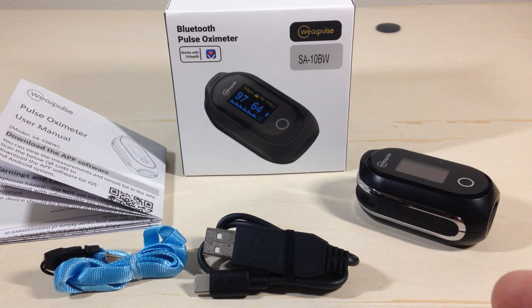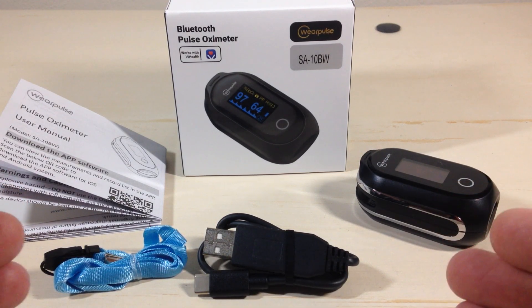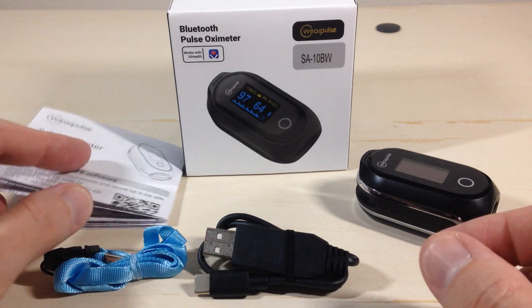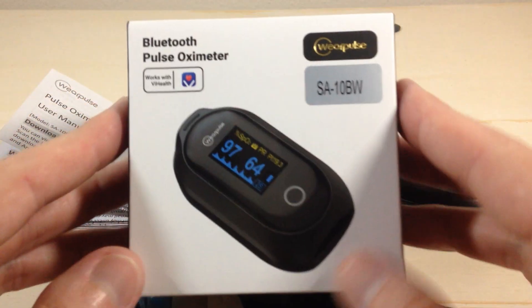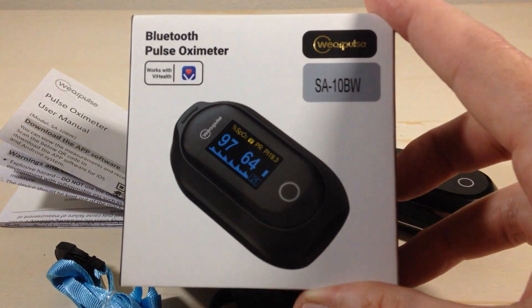Hey everybody. In today's video we're going to be taking a look at my latest Amazon purchase. This is the rechargeable Bluetooth pulse oximeter from the company WearPulse. With all my purchases, I like doing these videos because there's somebody else out there thinking about buying the same item — it gives you an idea of what it looks like when it comes in, what the quality is like, etc.